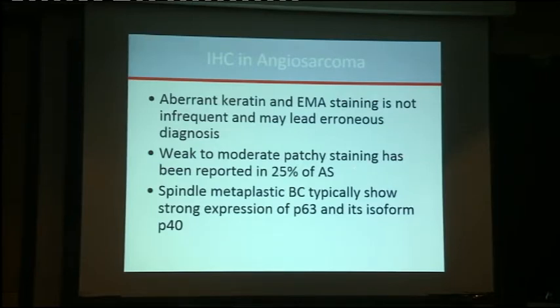In that case, the marker that we are using is P63 and its isoform P40, and these have been used in the clinic to make the diagnosis of metaplastic carcinoma.